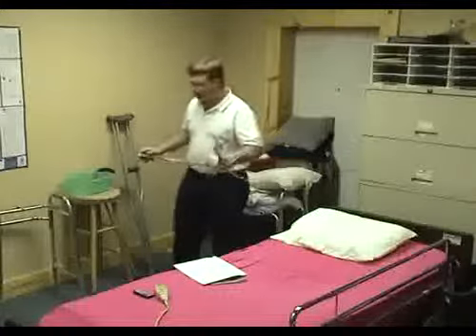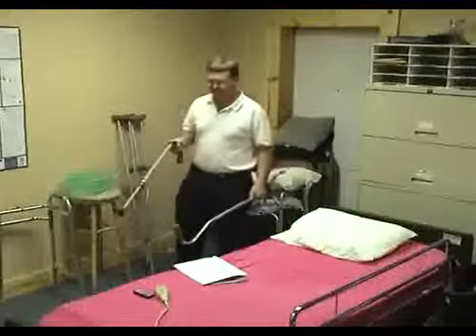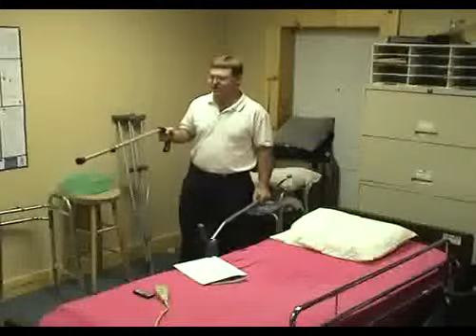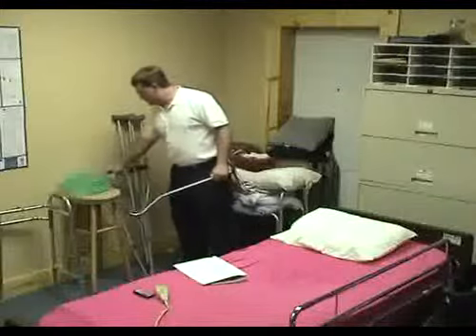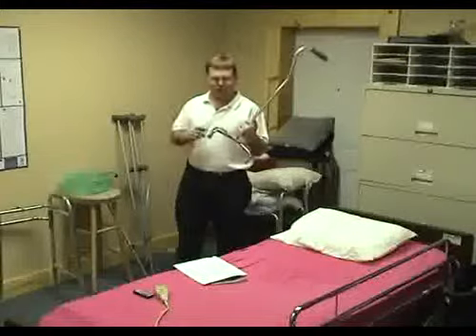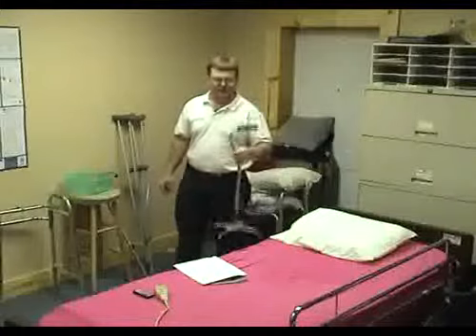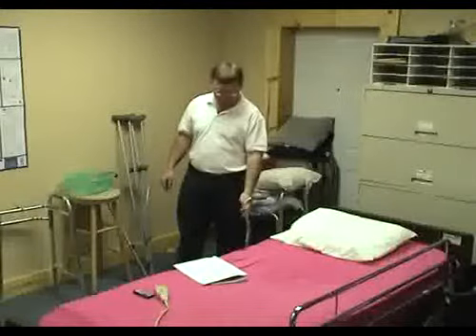This cane is much more stable than this cane. This cane you could use for someone that had maybe just a slight stroke, a little bit of weakness on one side, maybe foot surgery, something like that. But they still have some pretty good balance. If their balance isn't good enough for that, this is called a quad cane. Quad meaning four, because there are four points where it touches the floor. And because there are four points instead of one, it's much more stable.